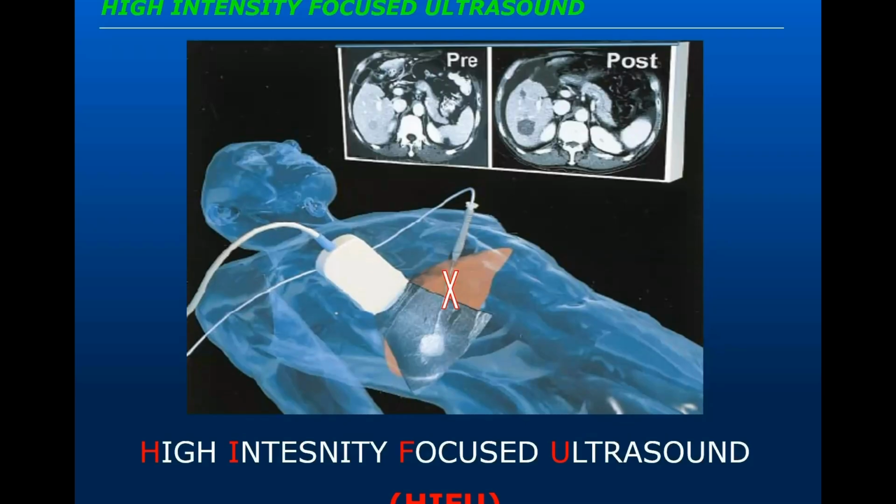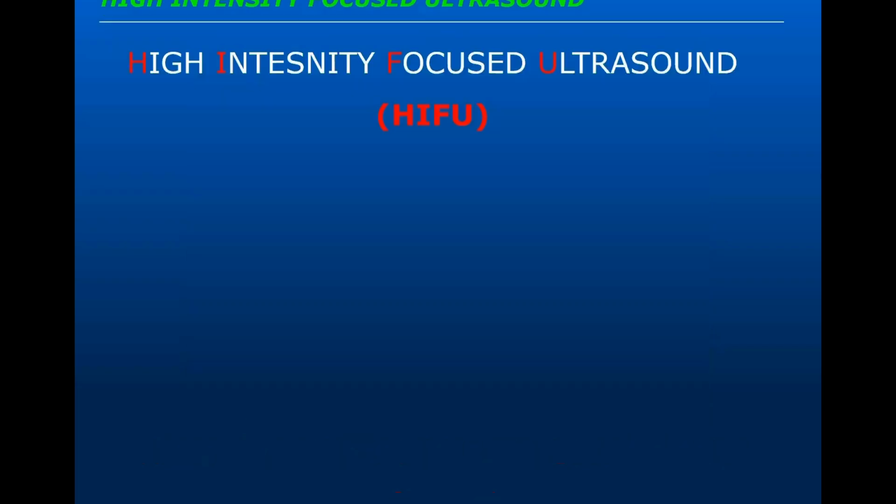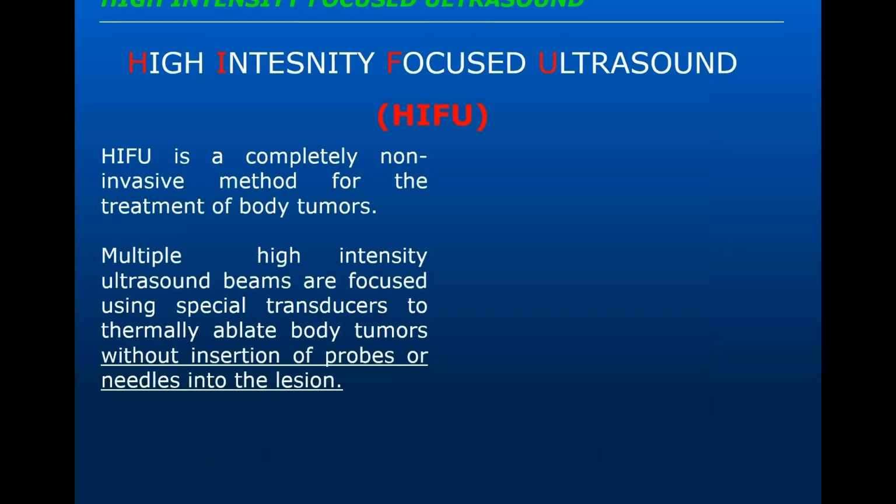Just for those of you who do not know my background, I spent about 5 years doing research only on HIFU. So I'm fascinated by this technology, and that's why I wanted you to know about it. So let's talk about it. HIFU, or high intensity focused ultrasound, is, as the name implies, a non-invasive method. It's not minimally invasive, it's non-invasive, for treatment of body tumors.